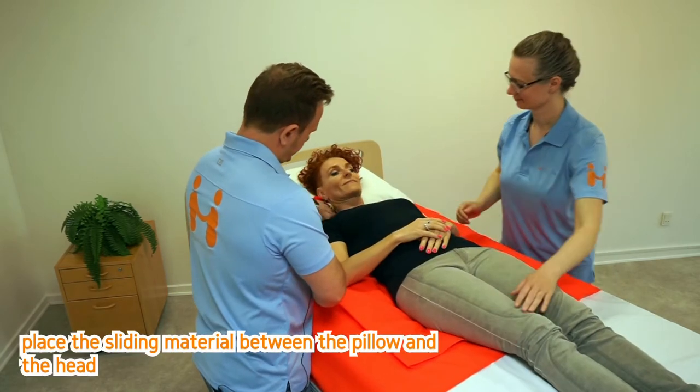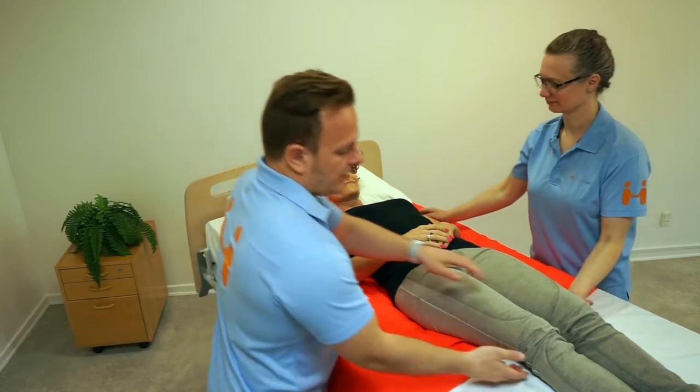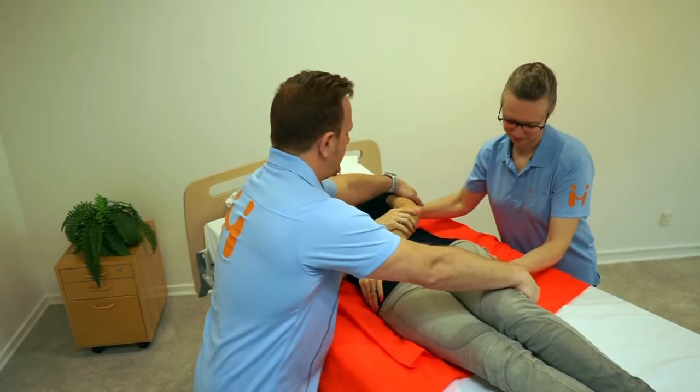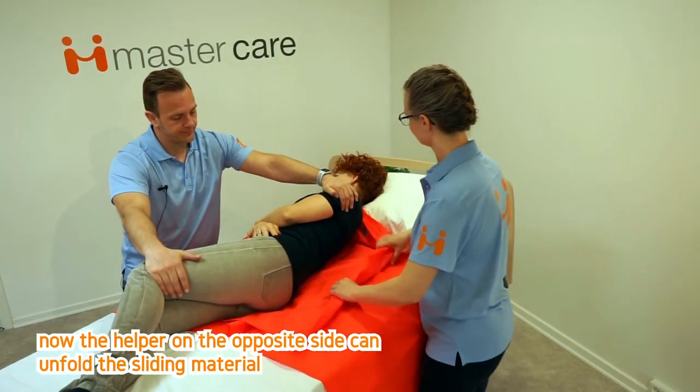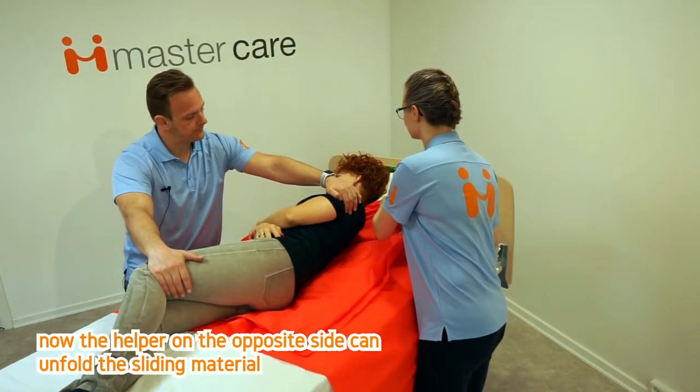Place the sliding material between the pillow and the head and tilt to the opposite side. Now the helper on the opposite side can unfold the sliding material.